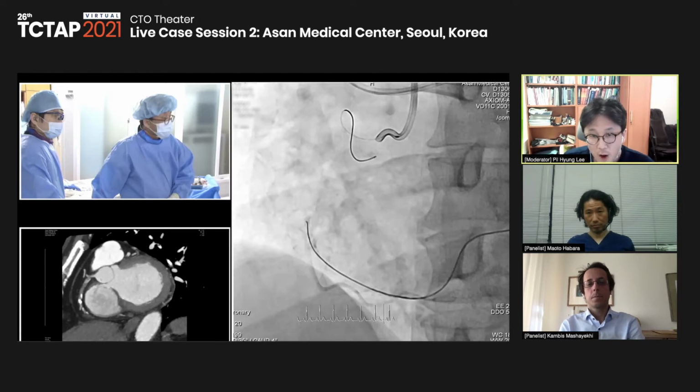If you have two options, epicardial and septal, of course you have to use the septal because we can make lots of backup, more backup with septal rather than the epicardial. But I chose the epicardial here because of those two reasons, and I was worried that the stent was already put in the ostium of the epicardial, but until now, I felt no resistance. That was a good portion until now.